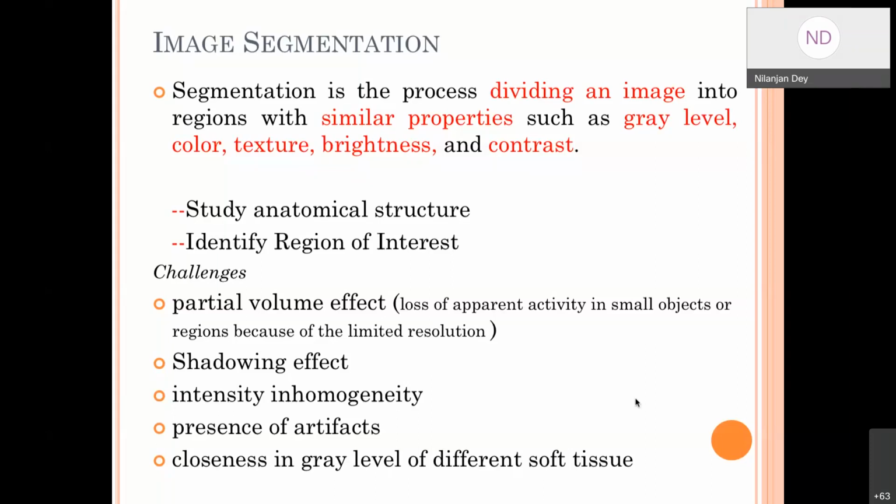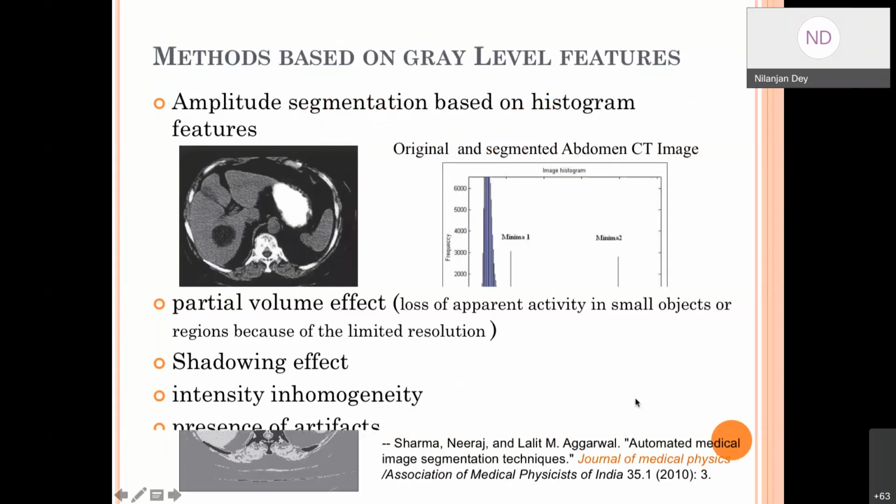For any kind of radiological images, you can try to find out the T1, T2 values by using some heuristic or meta-heuristic algorithm like say PSO, GA, ant colony optimization, or cuckoo search, or BAT algorithm. There is a tsunami of meta-heuristic algorithms. So you can deploy any kind of machine learning algorithm just to find out this T1 and T2. And these T1 and T2 will be different for all different modalities. It is not common for any particular type of image. It's not always the same for MR images. It's not like that. Or CT images, it's not like that. Even for the patient, if you change the patient, this T1, T2 will be different. And these optimized values will be determined by the heuristic algorithm. So this is one area where some people can work.